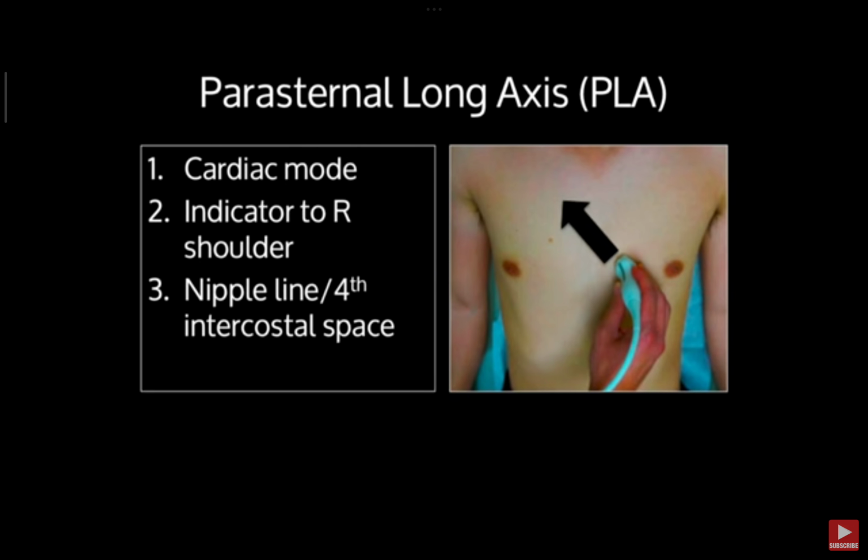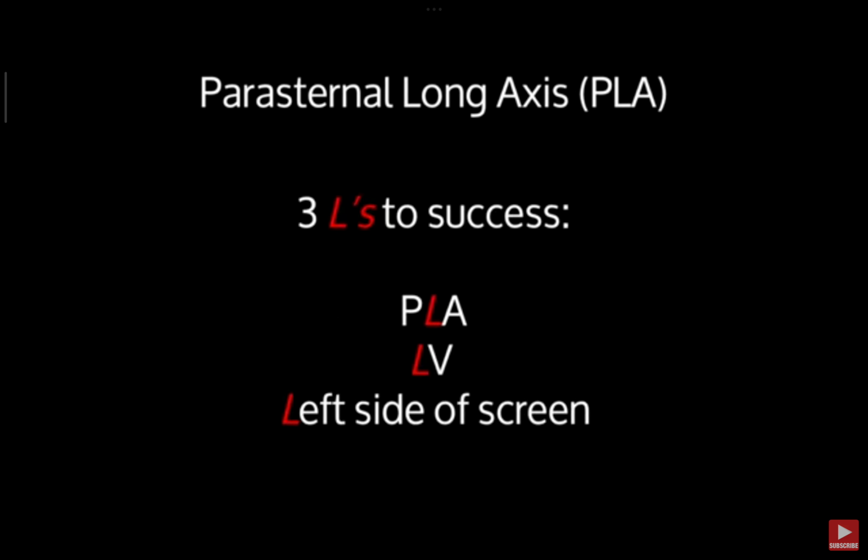Keep the probe perpendicular to the skin and hug the sternum as you go up and down the chest, searching for the best window. So I told you I would give you an easy way to remember the parasternal long axis view. You can remember it by the 3 L's to success.